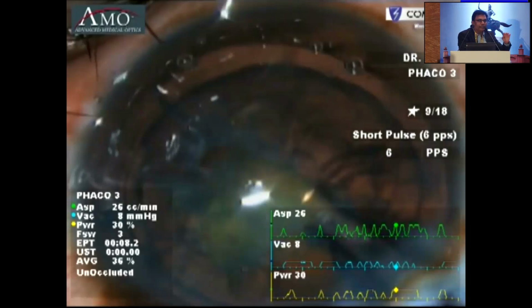A very important thing: I was doing one of the live surgeries in Jordan. I was not holding the mass. Suddenly the Alcon engineer increased the vacuum suddenly. So it is not vacuum and flow rate both. Not like that. Flow rate will bring the tissue towards you. Vacuum will hold, vacuum will maintain.